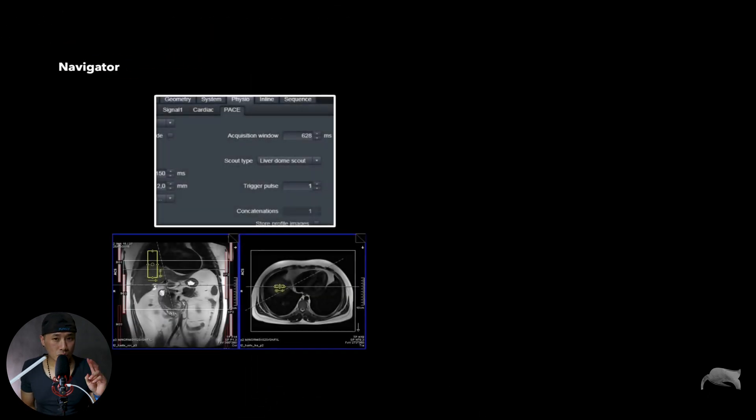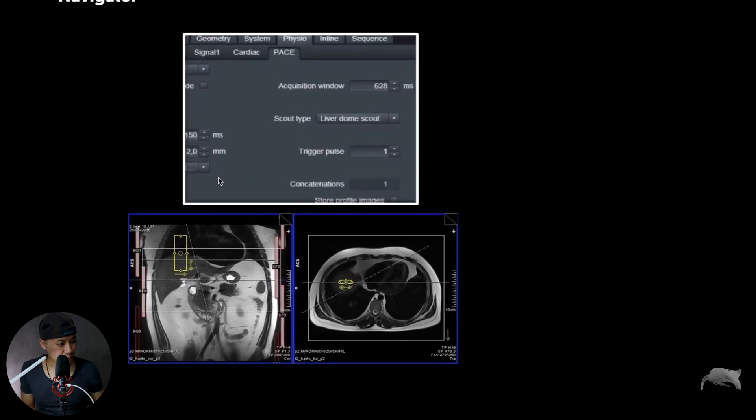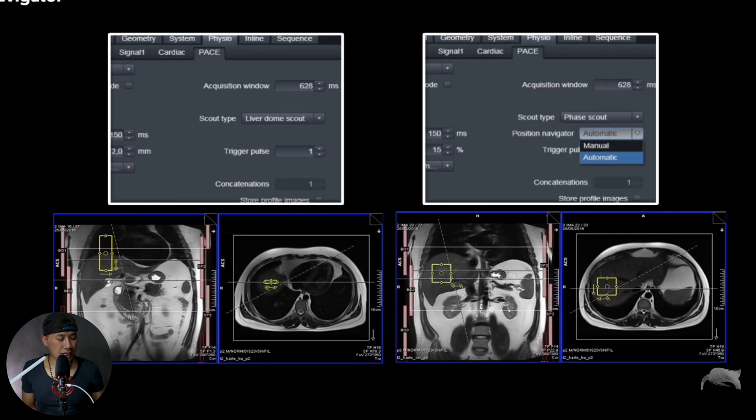For the navigator on Siemens, we have two types. One is liver dome — you put half of the navigator in the liver and half in the lungs, so it notices the difference between air and tissue. Remember to put it on two planes or else it won't work. The second option is the phase scout. Some of you use the phase scout, some use the liver dome. I prefer the liver dome.